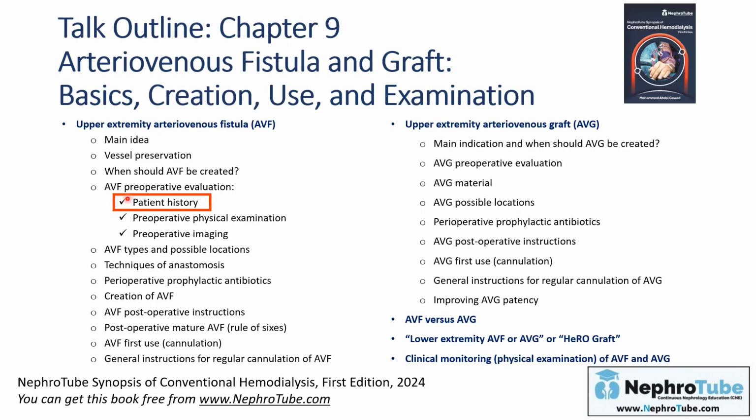Okay, about AVF preoperative evaluation. What is the preoperative evaluation that I should do for my patient before going for AVF surgery? For a good assessment and evaluation of our patient, first we will start by history, then physical examination, then imaging.